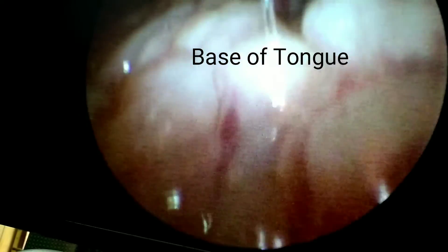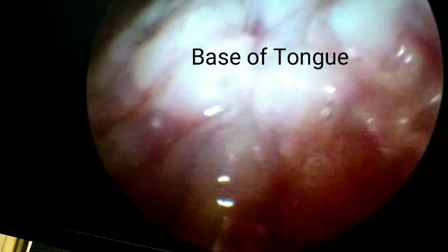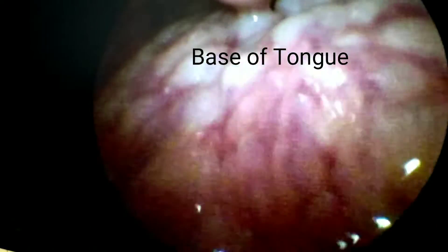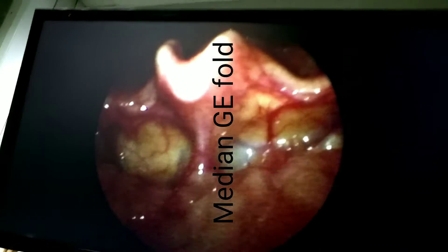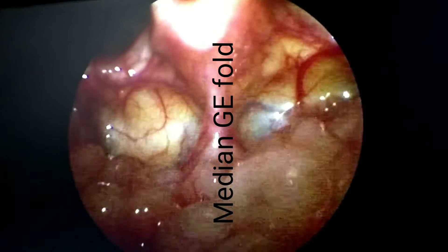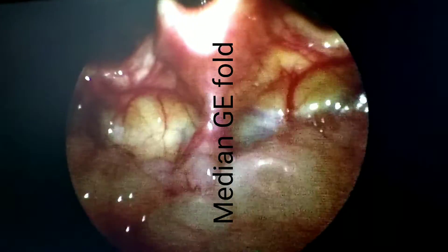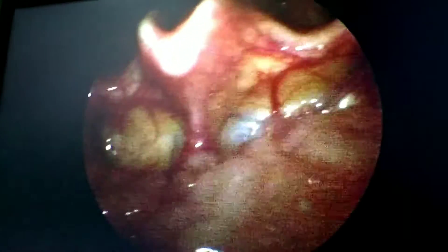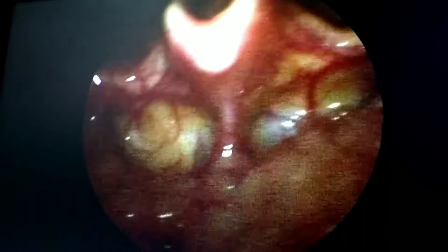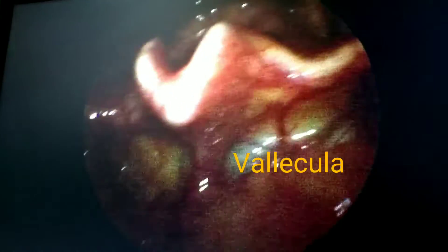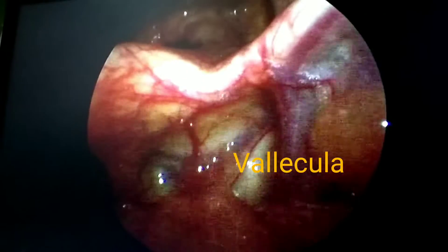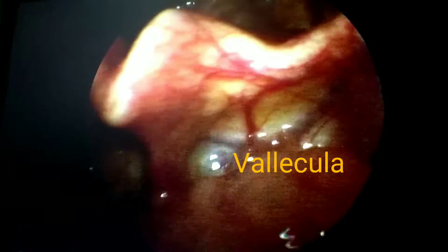We see the base of tongue; superiorly it is uvula. Then moving posteriorly, this is the median glosso-epiglottic fold between the epiglottis and the base of the tongue. On either side of the median glosso-epiglottic fold, there is a cup-shaped depression which is called vallecula, left and right.